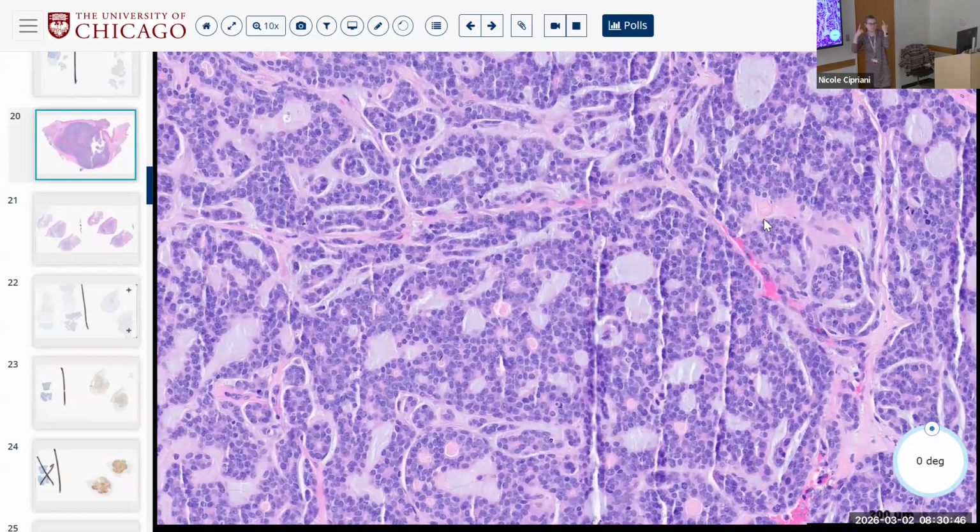They can all track backwards up into the brain. Then for any salivary tumor, you have to ask yourself, is it worse? Meaning, does it have overt dedifferentiation or high-grade transformation? Overt dedifferentiation or high-grade transformation in salivary means I can no longer tell what it is. It has lots of mitoses. It has lots of prominent nucleoli.